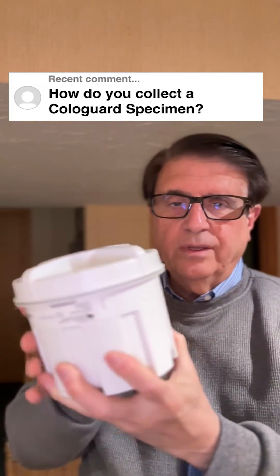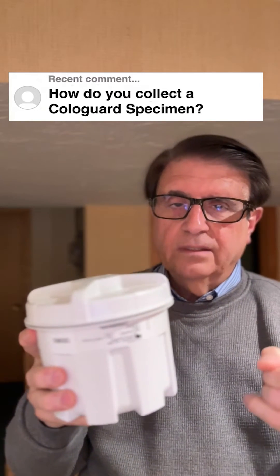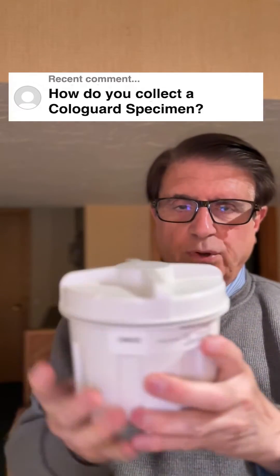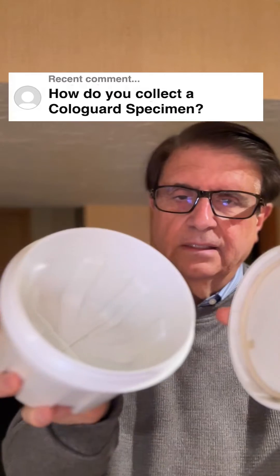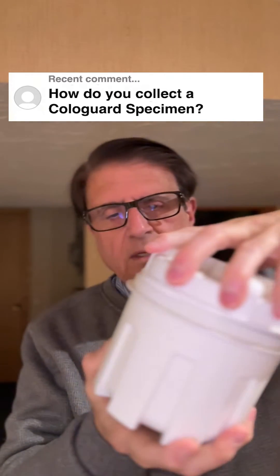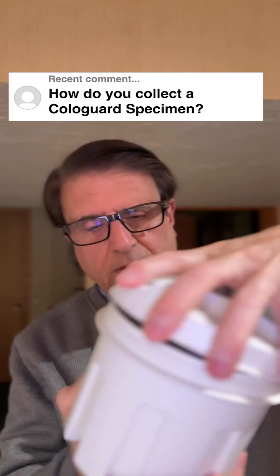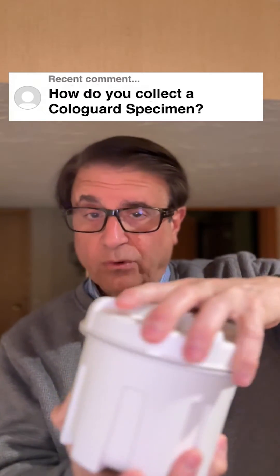And you basically poop in this container. No diarrhea, no urine, no blood — you just get a big specimen of poop in here. See, it opens up like that. And you put a preservative in there, and you seal it very carefully. Make sure it's sealed tight.